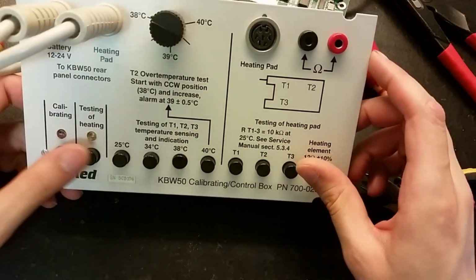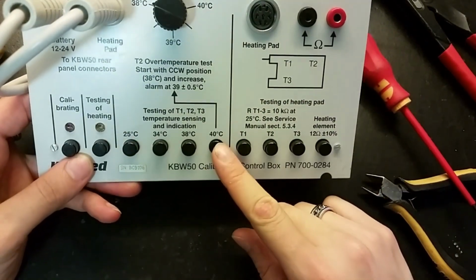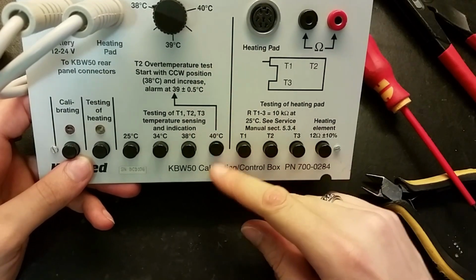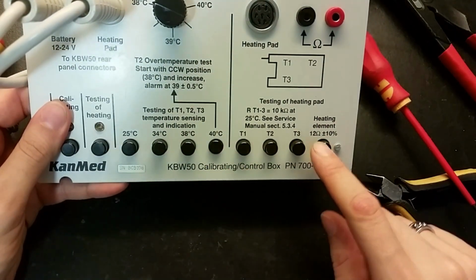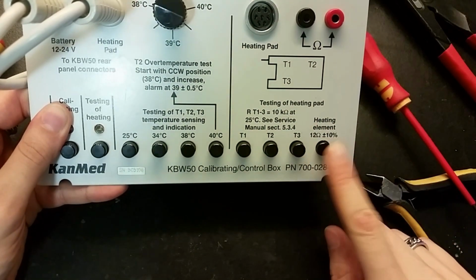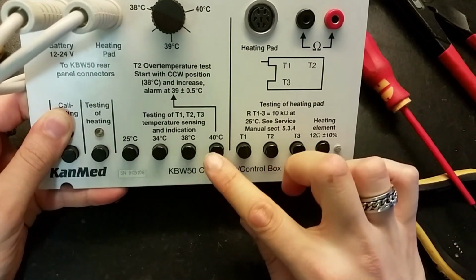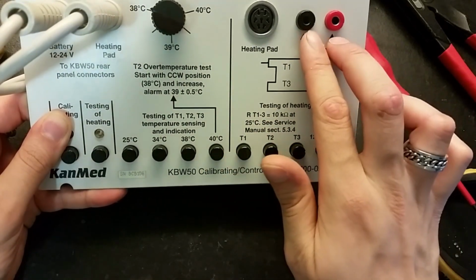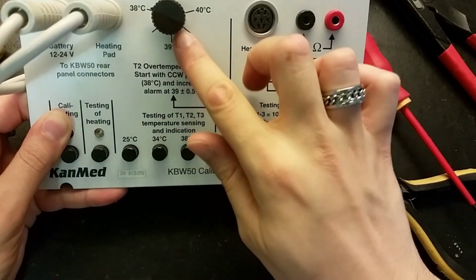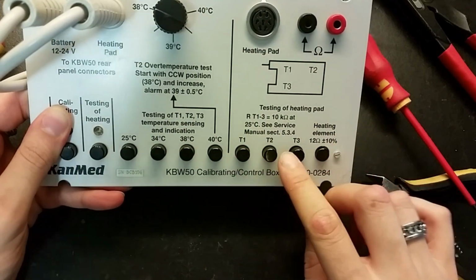And why they're actually using this kind of switches here: if you want to press this and test the power to 40 degrees Celsius, and if you actually want to measure the resistance, you can just push that in. You will get the resistance of the heater, and automatically this switch pops up like that, so you don't accidentally put the voltage that goes to the heater into your multimeter here. That's a very good solution actually.